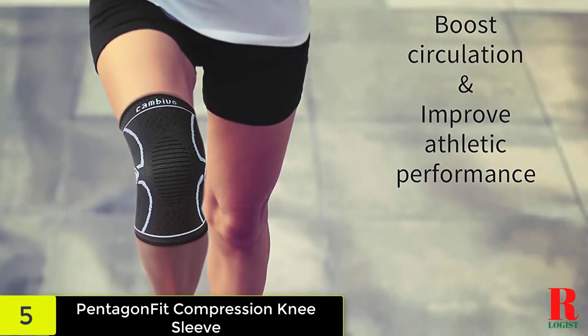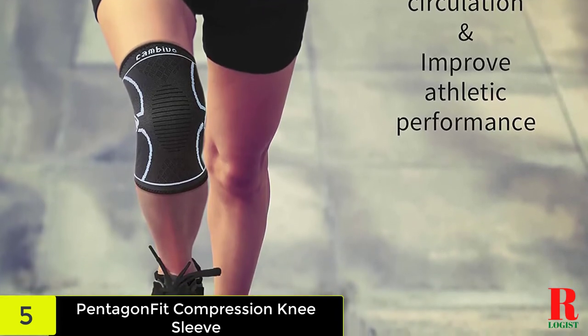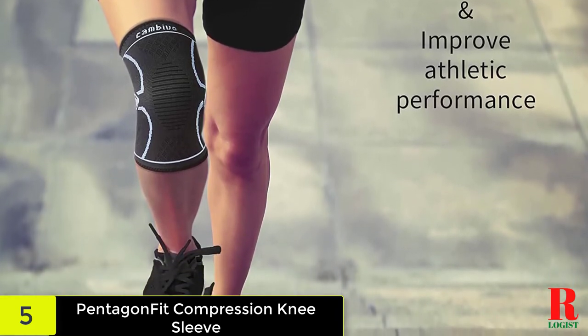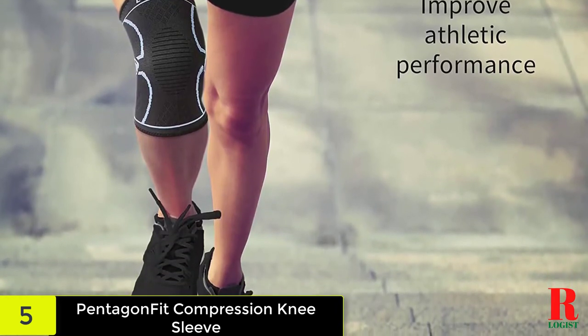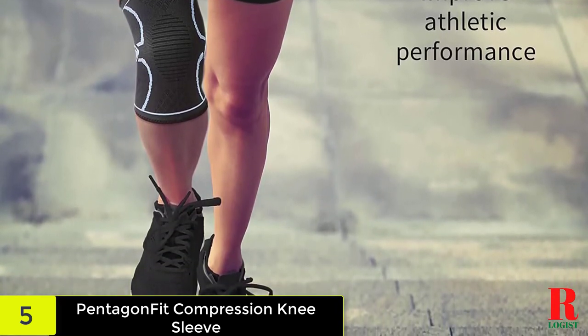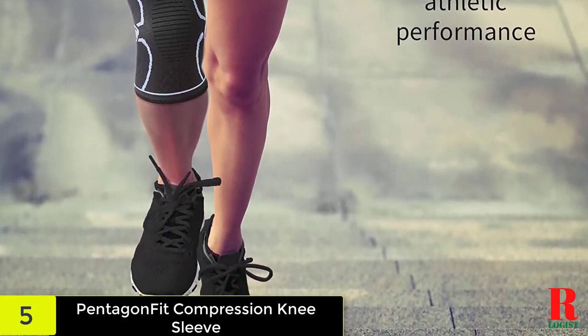The material is soft and flexible. You will be able to have a free range of motion for your knee without hyperextending it. Anyone can put the Pentagon Fit Knee Sleeve on with ease — sit down in a comfortable chair and pull it on as you would a sock. The brace is lightweight and compact, adding to the comfort of any type of pants you wear.